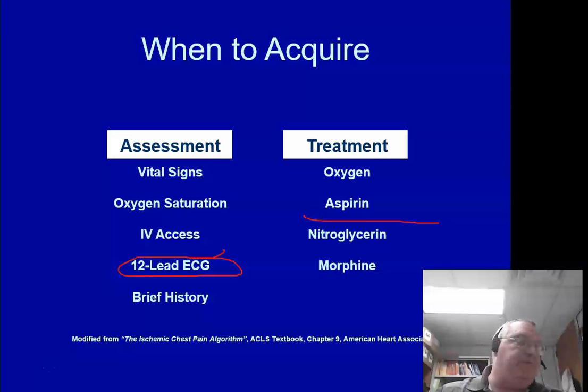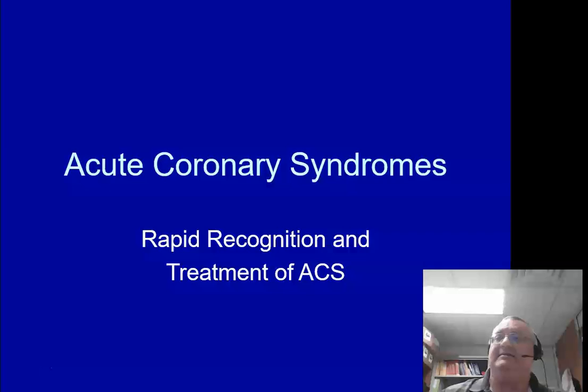Now, I'm going to save that one for a different video, because that's the 15 lead, and it's very, very important that you learn how to do that. But we're going to talk about that when it gets there.